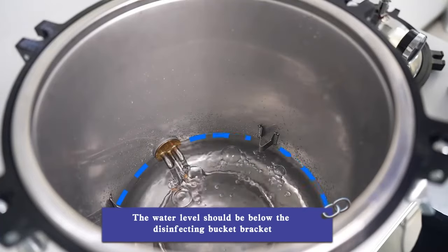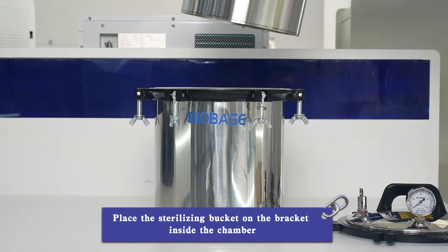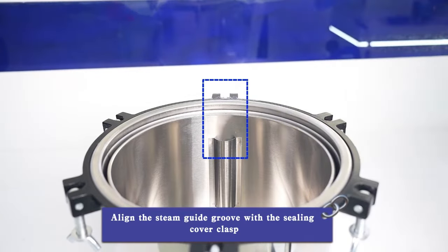The water level should be below the disinfecting bucket bracket. Place the sterilizing bucket on the bracket inside the chamber, and align the steam guide groove with the sealing cover clasp.